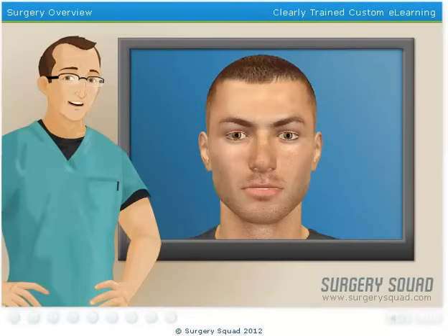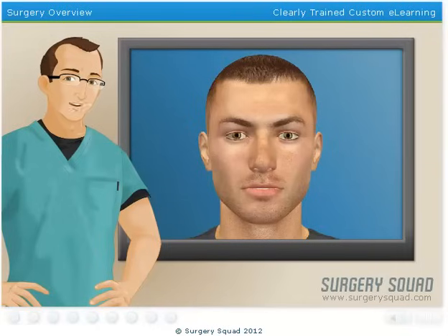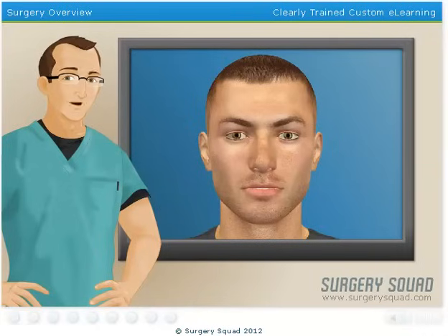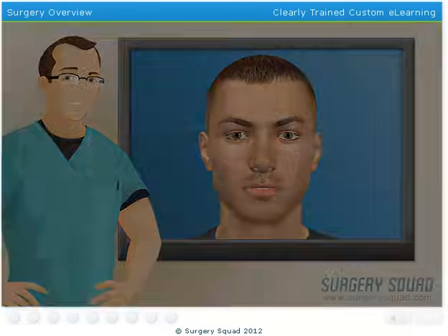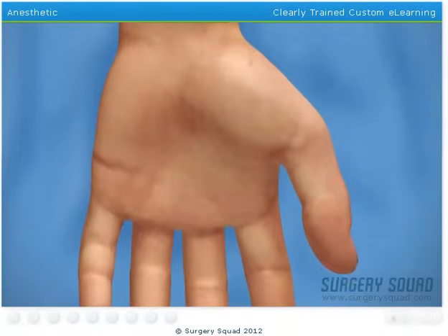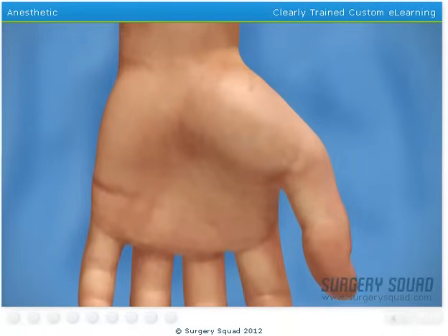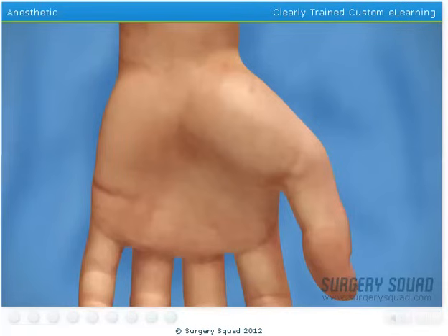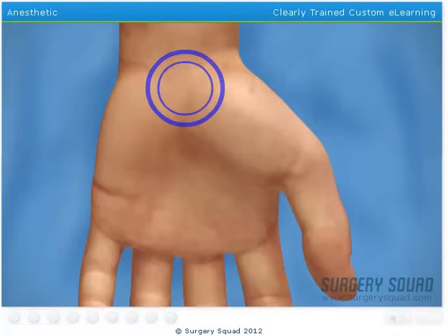Today we'll be operating on a patient who has been diagnosed with carpal tunnel syndrome after experiencing numbness and weakness in the palm of his hand and thumb. Now let's put on our gloves and get started. The limited open carpal tunnel release surgery is performed using a local anesthetic that numbs the carpal tunnel area of the hand and wrist.